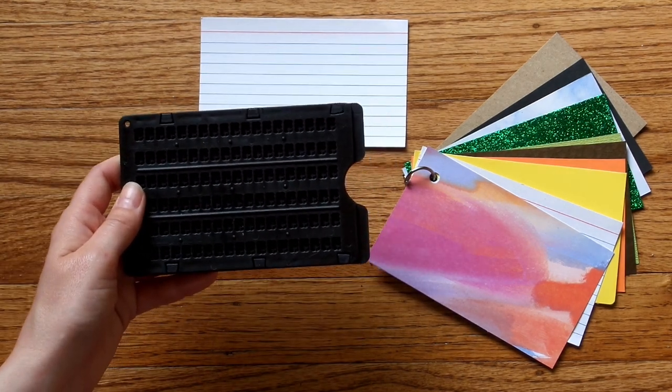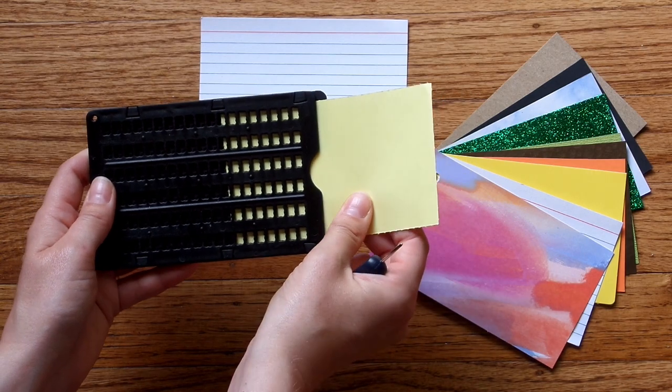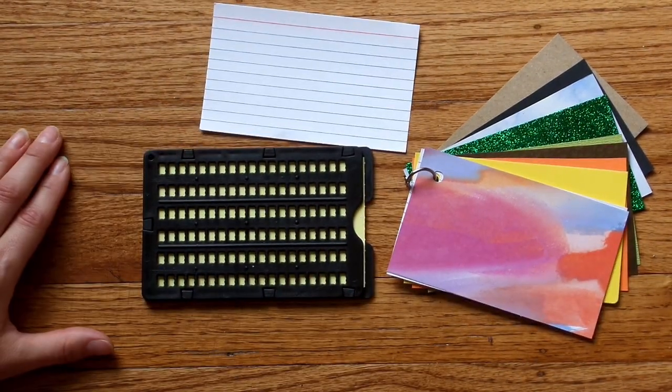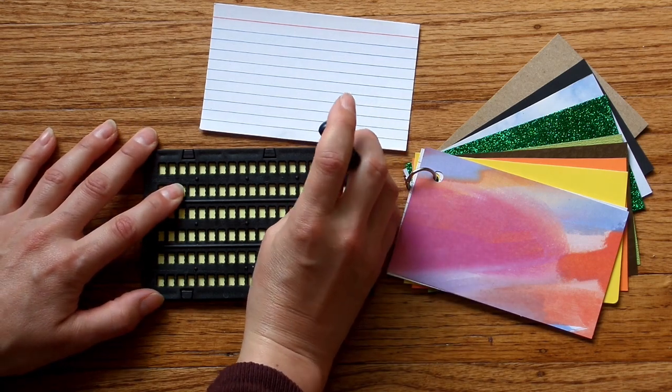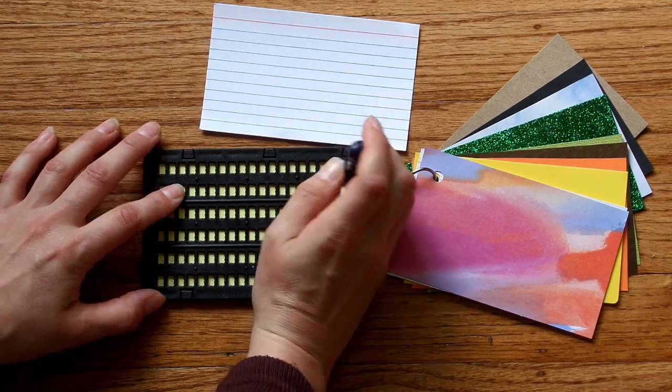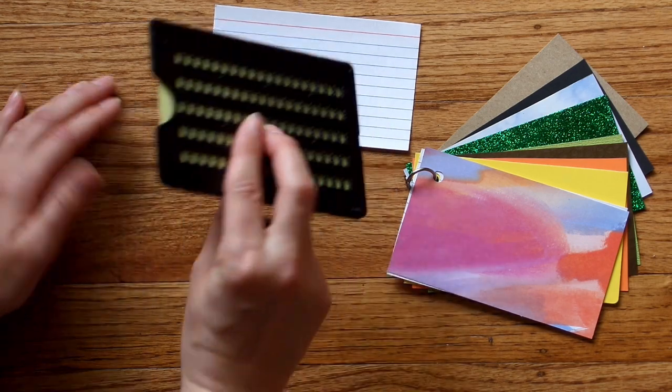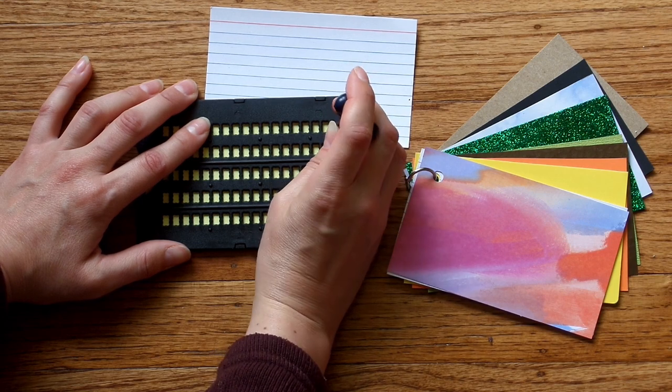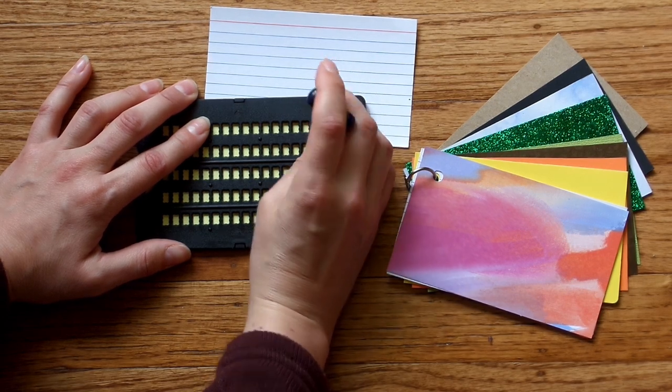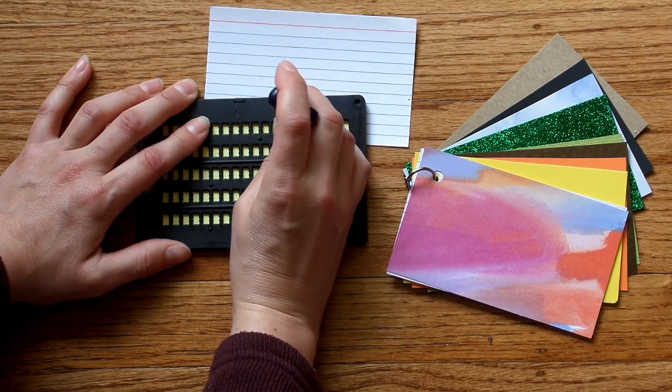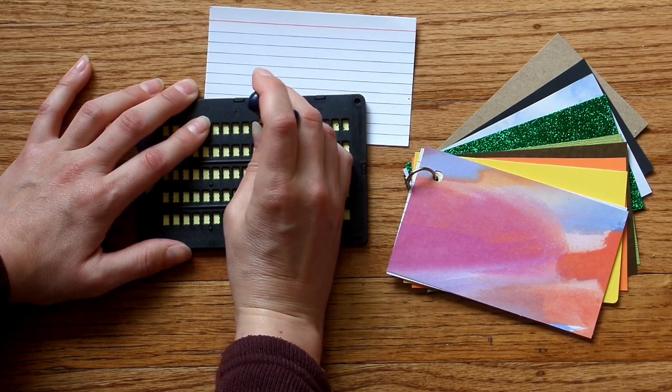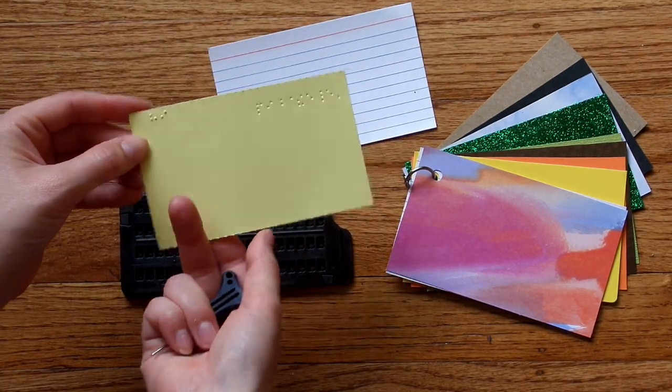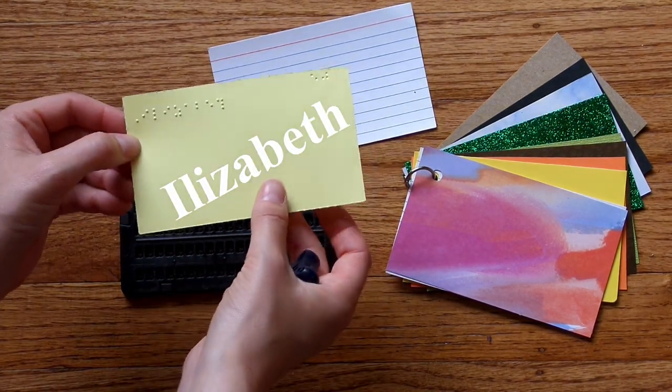So this slate fits a three by five index card. Slide that into the slate. Write all the braille on one side, flip the slate over, and then write some more. On one side, I wrote hi, and on the flip side, I wrote Elizabeth.